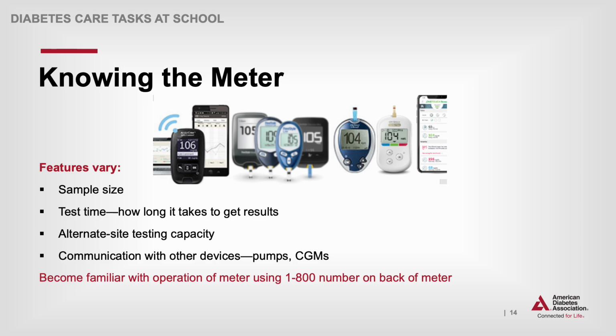Work with the parent guardian or school nurse to become familiar with the operation of the student's particular meter. Or, if not available, blood glucose meters have a 1-800 number on the back to call for questions about meters and to obtain technical support. Also, manufacturers' websites have videos, demos, and user guides that may be downloaded.